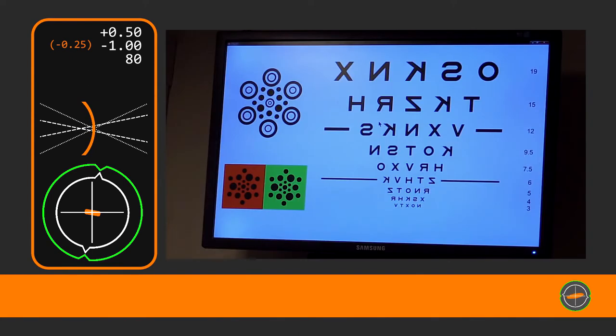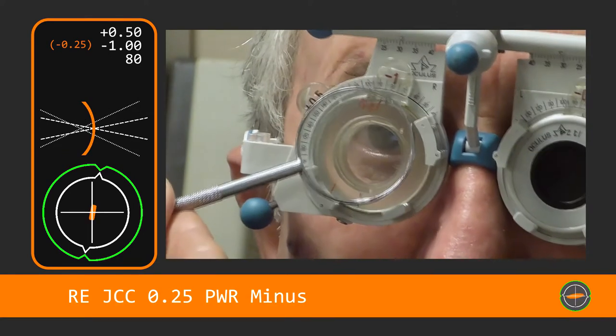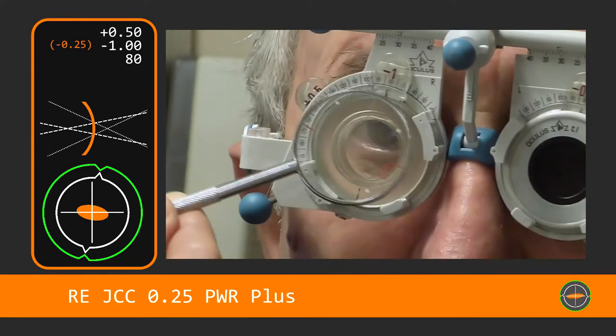So if we go back down to the letters again. You've got the ZCHVK — yes. Maybe the one just underneath? Difficult. So now we have a dilemma: is it the minus one or the minus one twenty-five, like the patient was wearing before? How do we decide? Let's see what our experienced optom does.